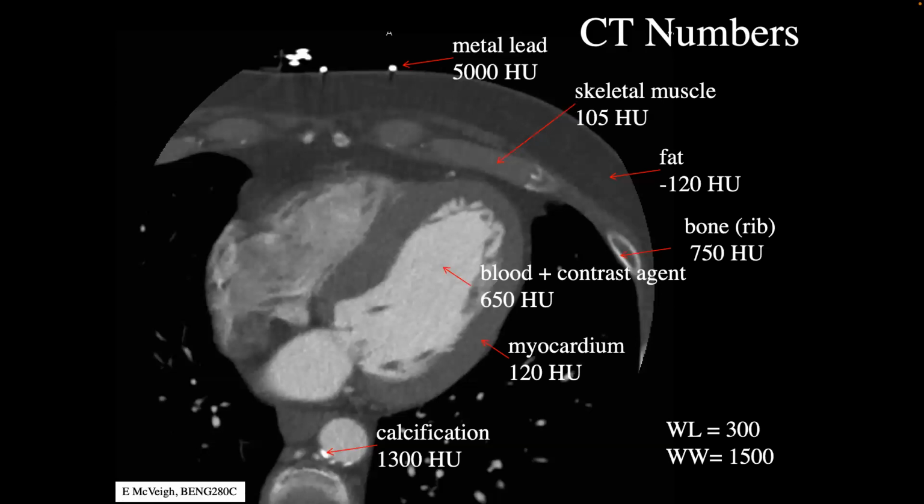Think back to the formula. It's mu minus mu water divided by mu water, right? So that number is 5, right? And you can see when you have something this big, it casts a shadow, right? Because this is a very high number. And so it's really hard to estimate what the true value is really close to that thing. So if you go down into the noise, you'll see a lot of rays coming off this.